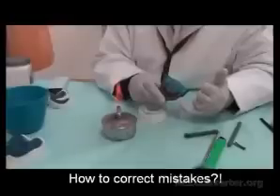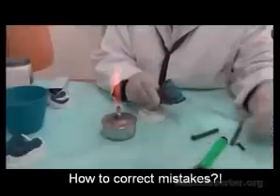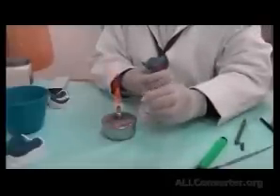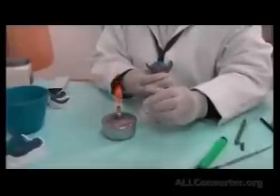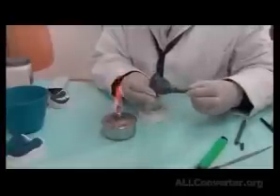I have a bubble or discontinuity here at this site. So, what is good about compound material, primary or border molding material, is that it's reversible, and I could correct it easily. So I'm simply filling it in this area where it was deficient.